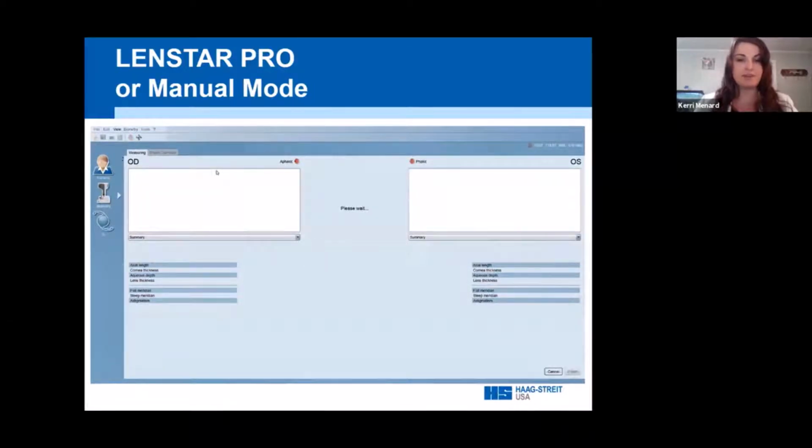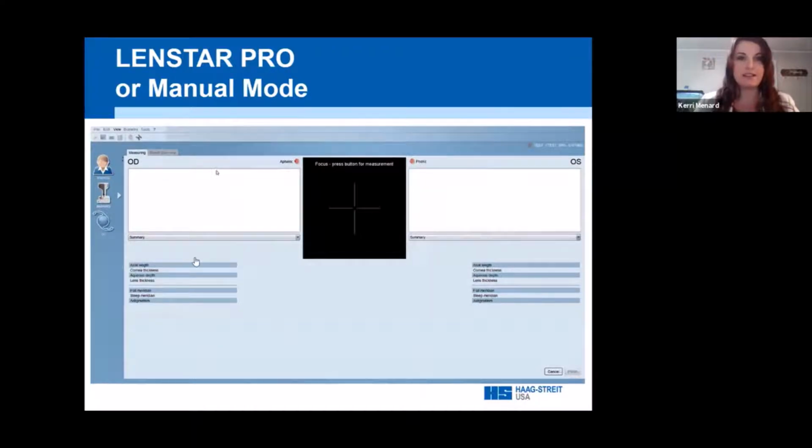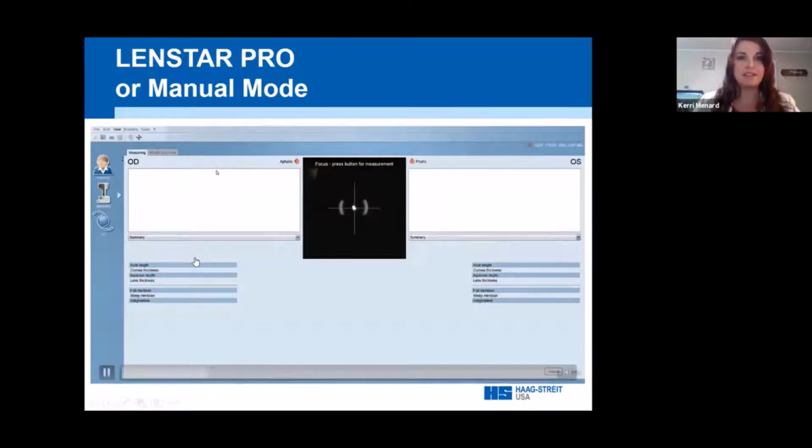The technician will begin starting defocused all the way back towards them, and then they'll center on your patient's eye and move closer towards them until those 32 points look clear, and then click the button. Now you'll notice at this point they'll go closer towards the eye, and it is important that you want these double parentheses to be clear.